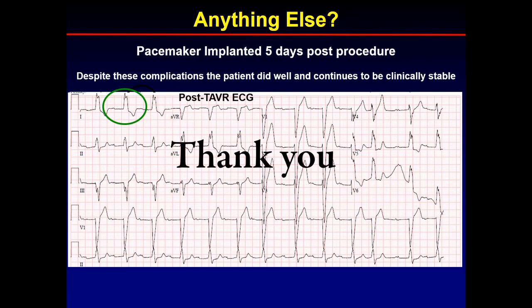I mean, there are obviously small randomized trials led by Sushil Kodali and some others on the role of protection devices. In standard practice, do you use a protection device, or how do you determine? The stroke rates are so low, extremely low in low risk, and the data for protection devices as a whole failed in the randomized clinical trials to show a benefit, clinically or even by MRI perfusion defects. But if you gather a series of studies and do a meta-analysis, you may see some direction that it is protective. There is no doubt it does collect debris, but I think the brain is much more forgiving.